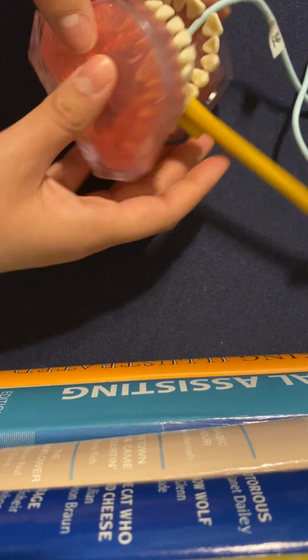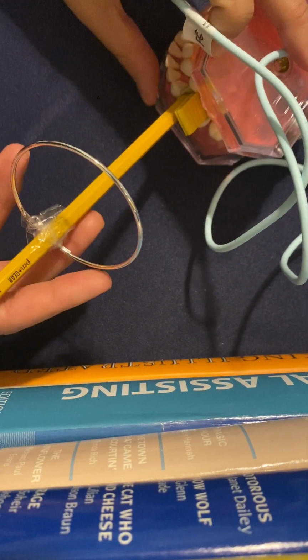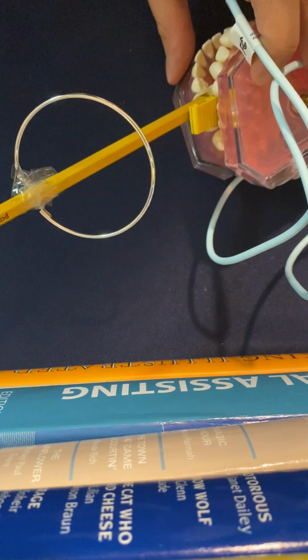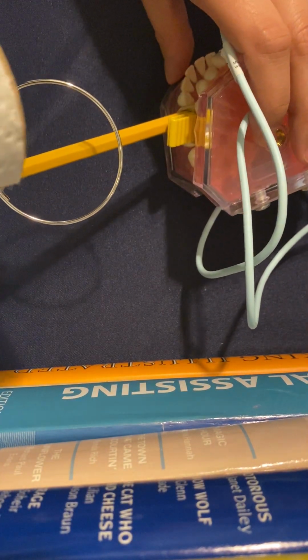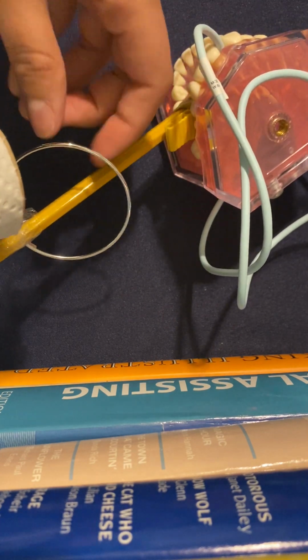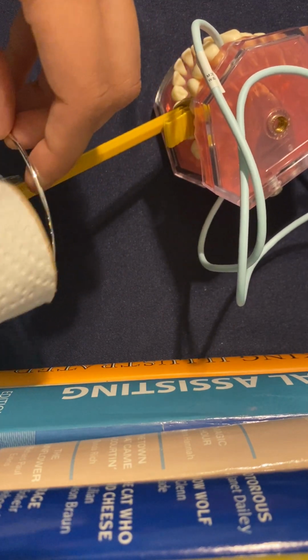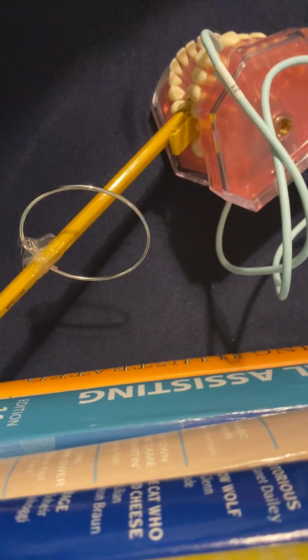Bite down, much like that, and there you go. And the central ray, you're going to want to point down from the outer canthus, the outer eye, I'll show you on me in a second, to the mid cheek area. You're going to want to go straight from there. When they say the outer corner of the eye, I don't know if they mean this part of the eye.